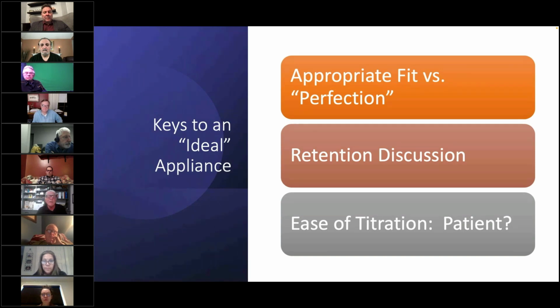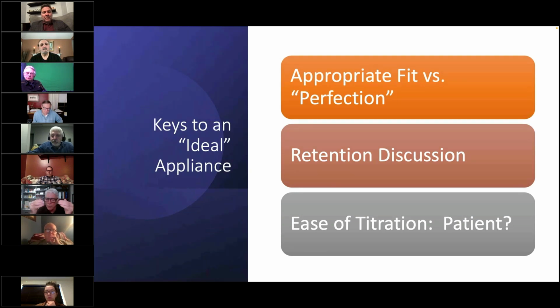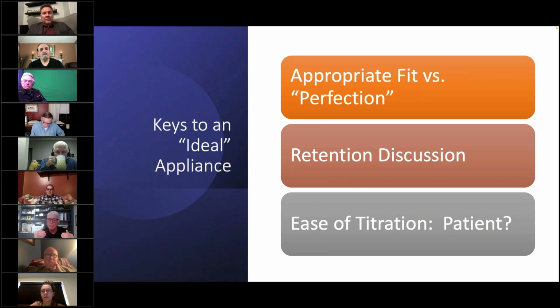One, appropriate fit versus perfection. Now, this is difficult for me because some of the work of the newer appliances, to be honest with you, is excellent. I am not in any way, shape, or form being negative about the newer printed, well-constructed, good-looking appliances, no question. The suggestion that they're better because they fit perfectly makes zero sense to me, zero.